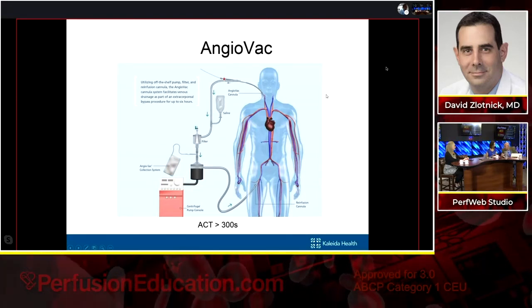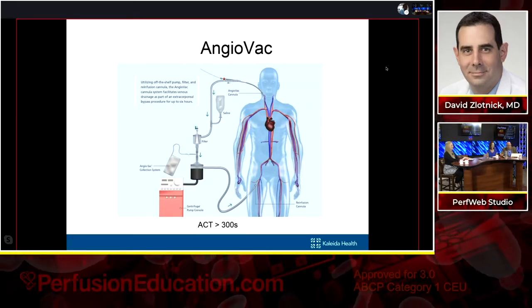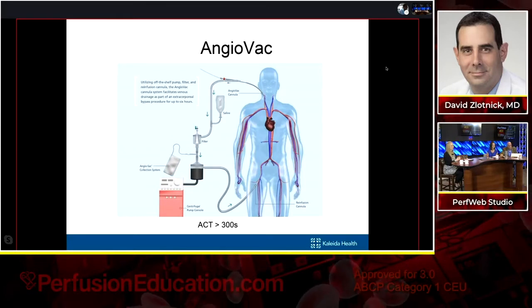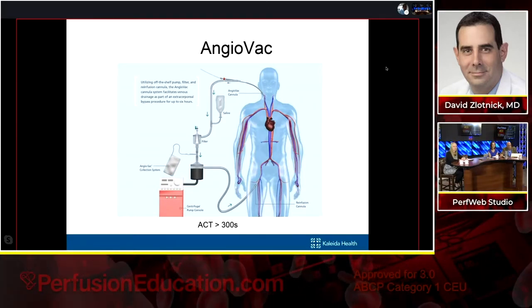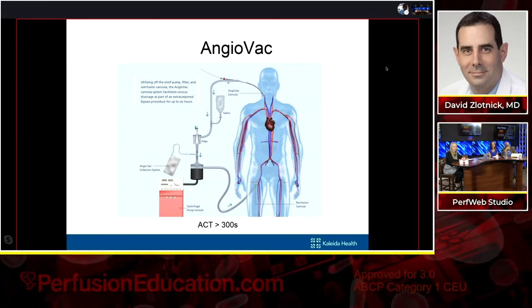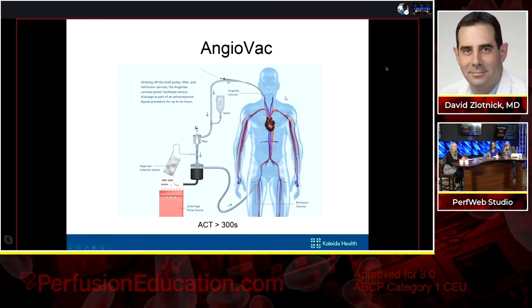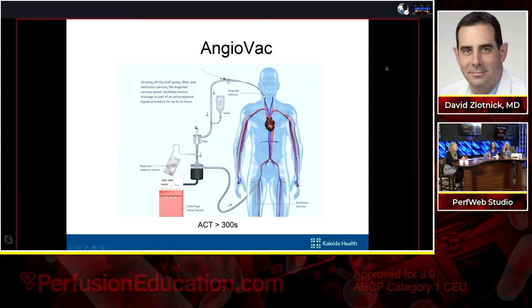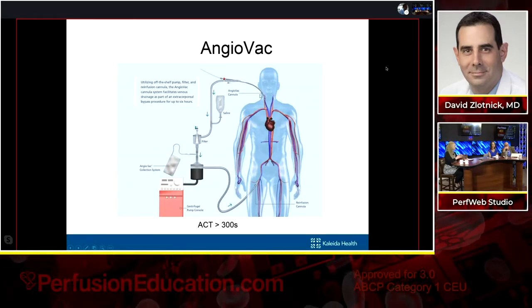So when we're looking at taking care of the patient, we have to think about where the aspect of the clot or the vegetation that we're going after is, that allows us to think about what our access sites are going to be. And as I said, for the majority of these procedures, we're doing veno-veno access. So in this picture, the access is in the right IJ through a 26 French sheath, and that's where the AngioVac cannula is going to go.